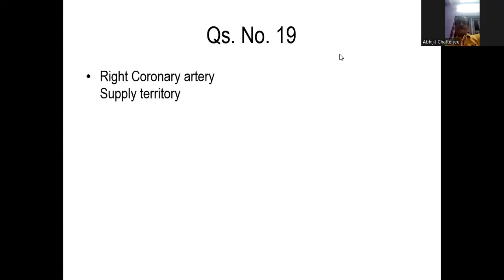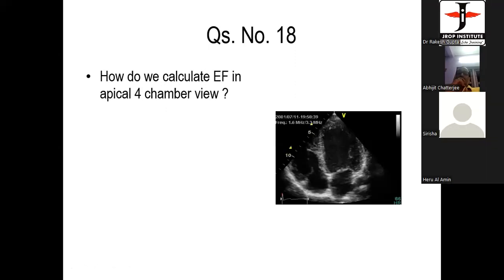Dr. Sumant Kumar, can you hear me? Yes, sir. Sumant, can you show me the 4 chamber view, please? Okay, I'll show you. I am interested in knowing whether the right ventricle of this person is normal or large. How do I do that? Sir, is it normal or enlarged? It's dilated. It's enlarged, sir.